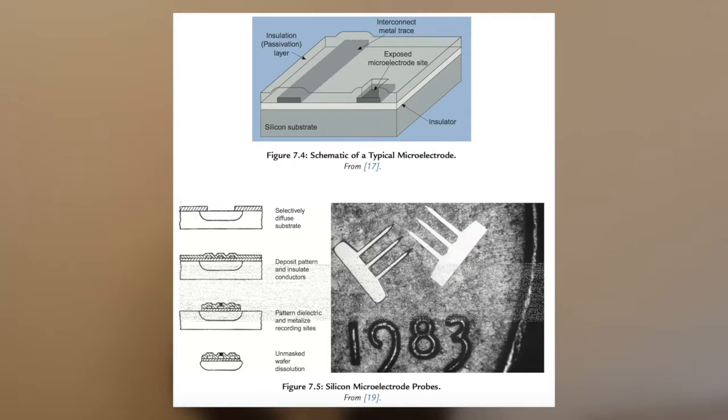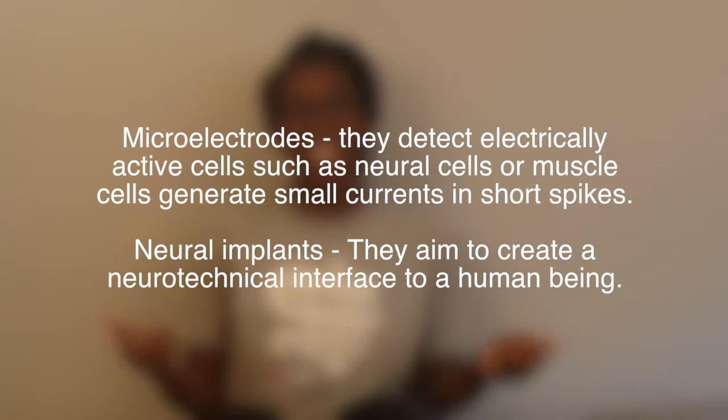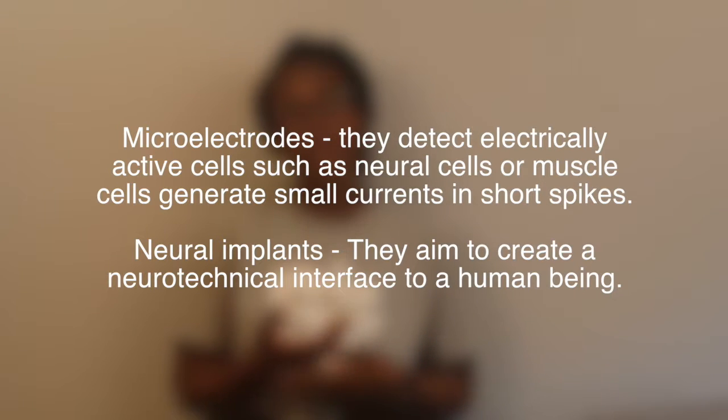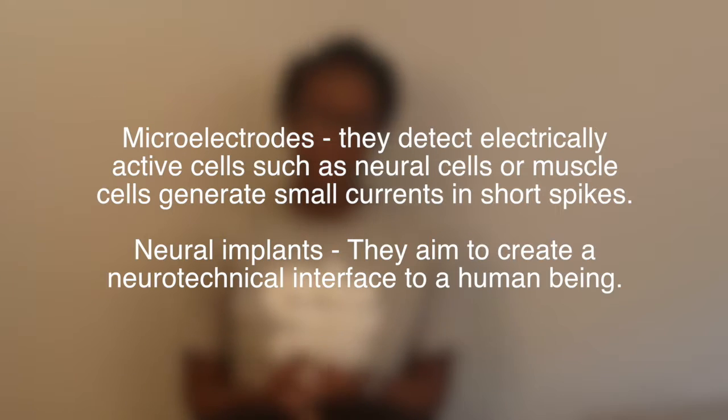Now, there are different designs for these types of electrodes, but you should know that basically these electrodes are used for sensing and stimulating, and they detect electrically active cells such as neural cells and muscle cells that generate small current in short spikes that are called action potentials. And so the metals that are actually used, which are pretty biocompatible to the human body, are gold, platinum, titanium, and iridium. Now, the other types of implants are neural implants.